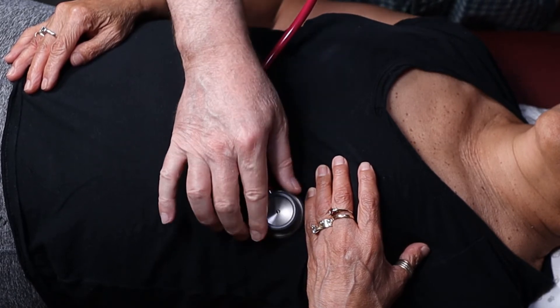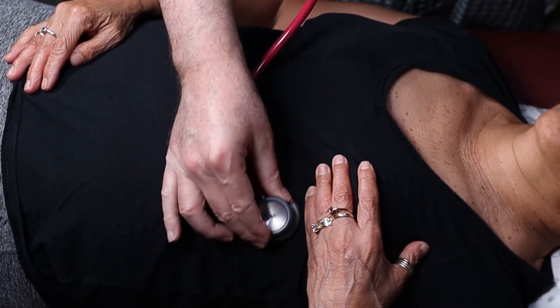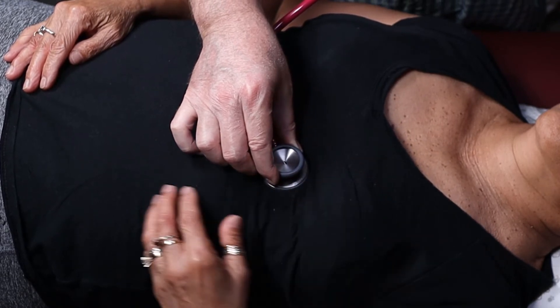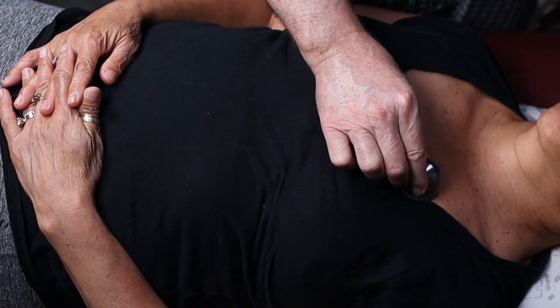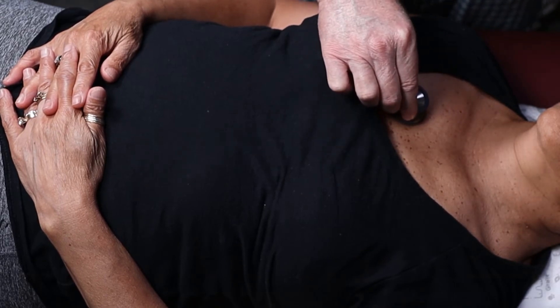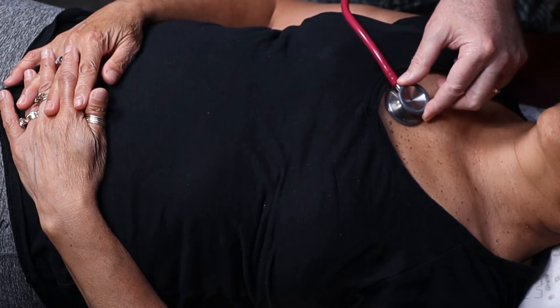So that was pretty much it. You can also go backwards: mitral area, tricuspid area — you can release your breast tissue now — tricuspid area, Erb's point, pulmonic area, aortic area, pulmonic area. It's pretty much just as simple as that.